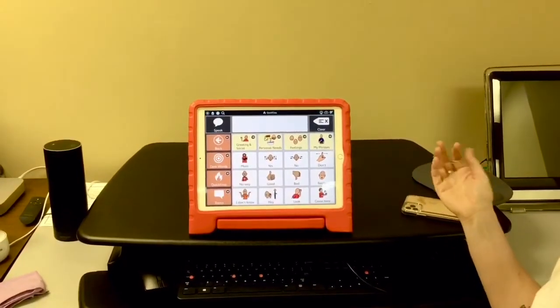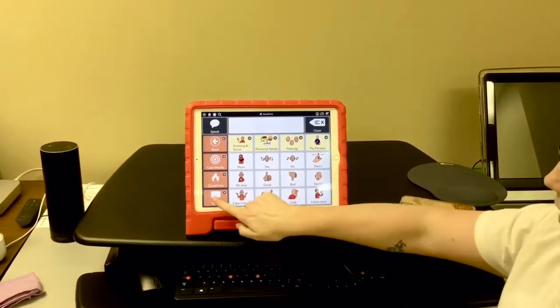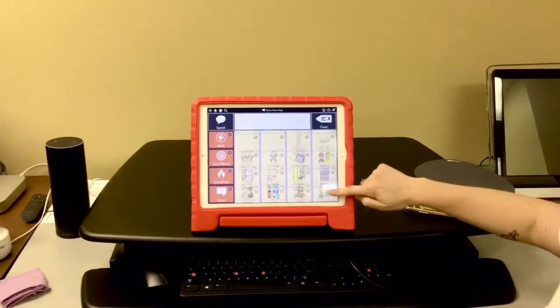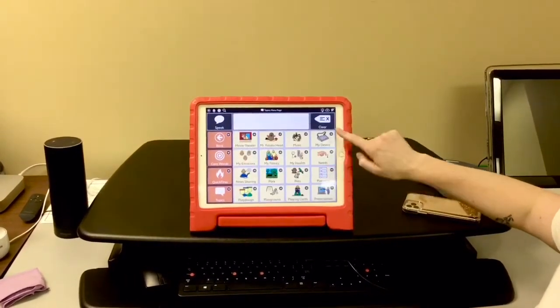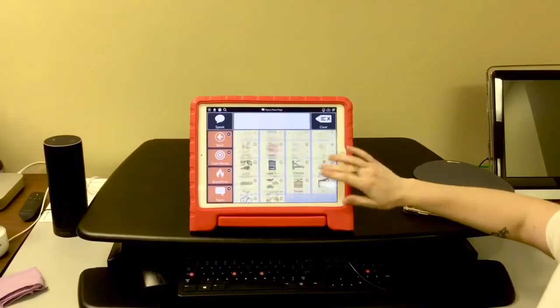If your favorite phrase is "what's up," this would be a place to store that. Topics is set up in alphabetical order and covers everything from all about me to presentations, snacks, toy play, zoo.